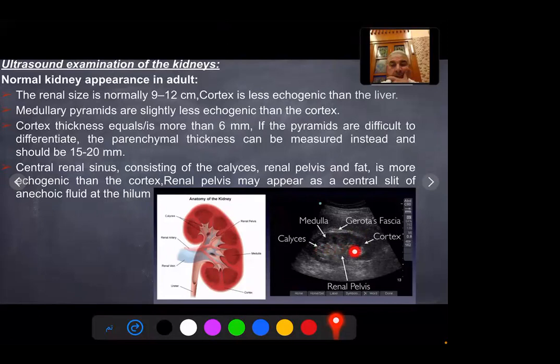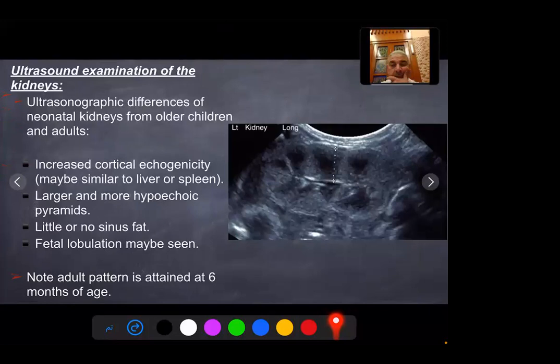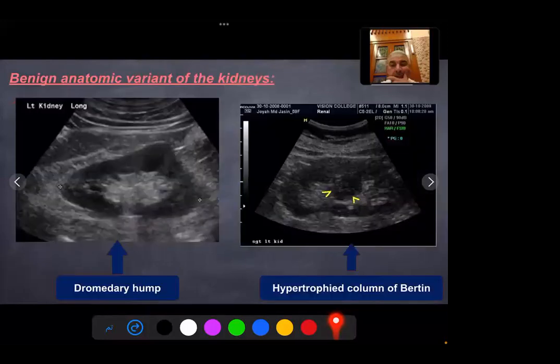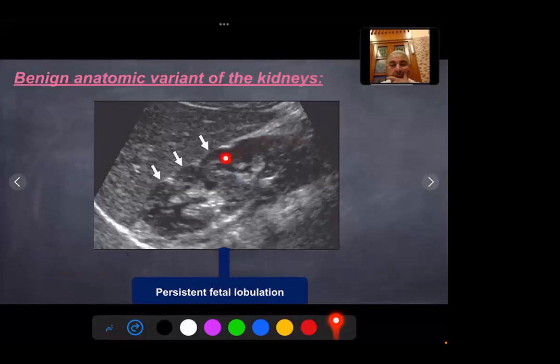Ultrasound: renal parenchymal thickness and renal size is normally 9 to 12 cm; the cortex is less echogenic than the liver. Medullary pyramids are less echogenic than the cortex. Cortical thickness is equal to or more than 6 mm. If the pyramids are difficult to differentiate from the cortex, parenchymal thickness can be measured, which equals 15 to 20 mm. The central renal sinus consists of renal calyces, renal pelvis, and fat, and is more echogenic than the renal cortex. Renal pelvis may appear as a central slit of anechoic fluid at the hilum. In neonates, cortical echogenicity may be similar to the liver or spleen, with larger and more hyperechoic pyramids and little or no renal sinus fat; fetal lobulation may be seen. Adult pattern is attained at 6 months of age. Benign anatomical variants include Dromedary hump, splenic hump, and hypertrophied column of Bertin, which should not be confused with renal mass, and persistent fetal lobulation.